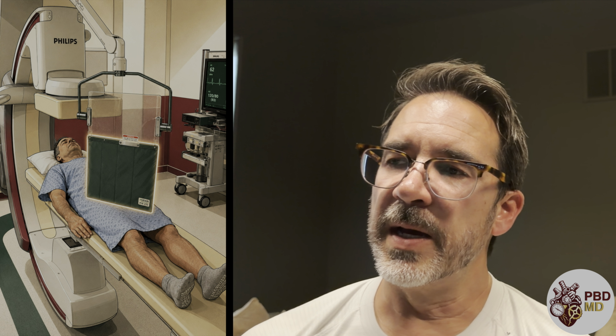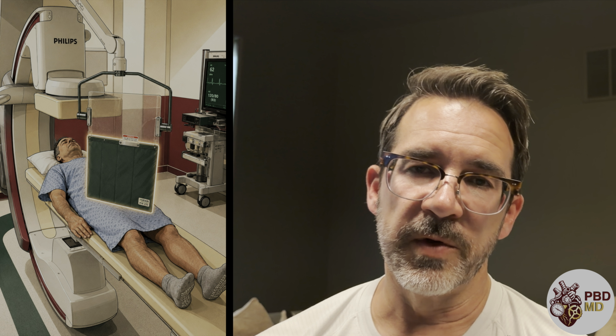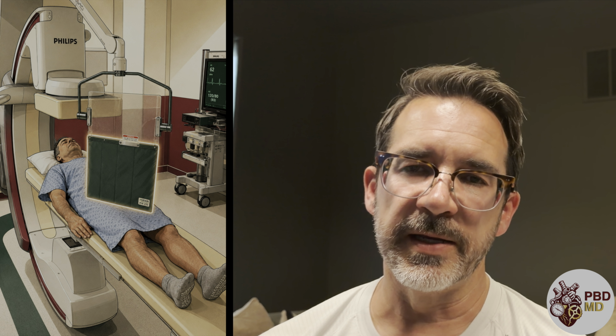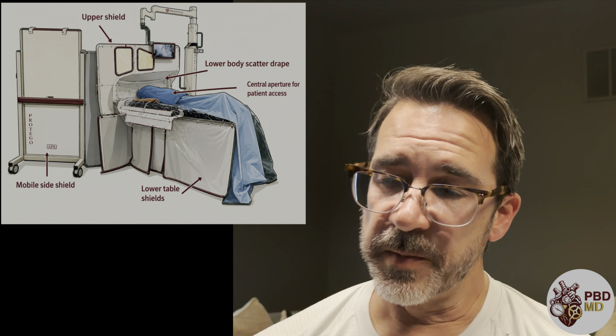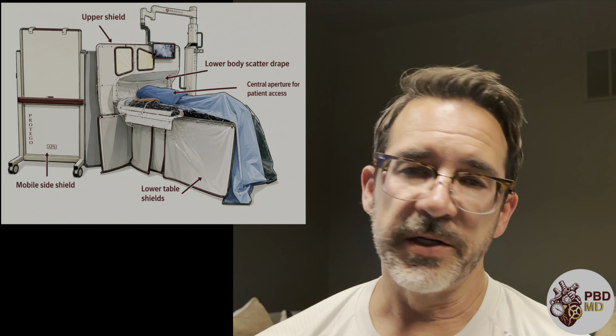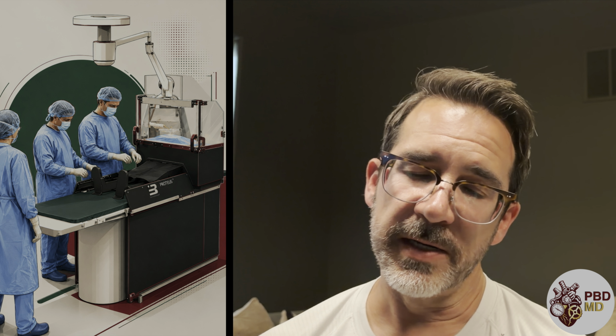Usually it's not so much that it's going to cause any sort of trouble, but for those of us who are working in the lab, we're in there day in, day out, potentially a lot of exposure, so we wear lead. We have lead shields that you'll see. And then with this particular setup, it's actually quite nice. We put this lead paneling essentially around the patient, sort of at the level of the pelvis or maybe the abdomen. And then we can stand to the side without wearing any lead.